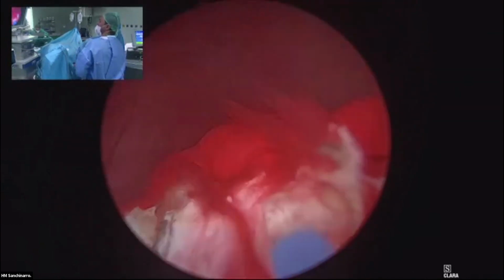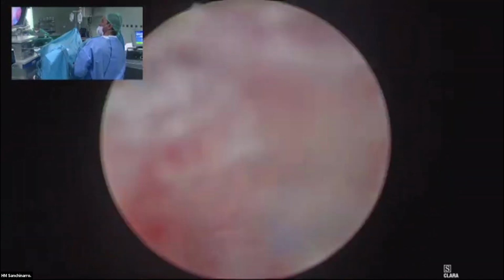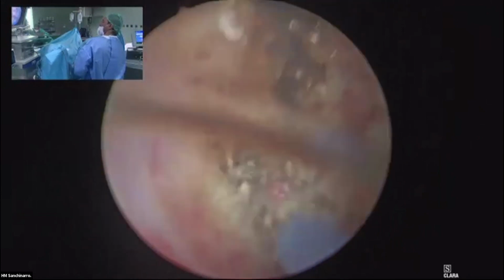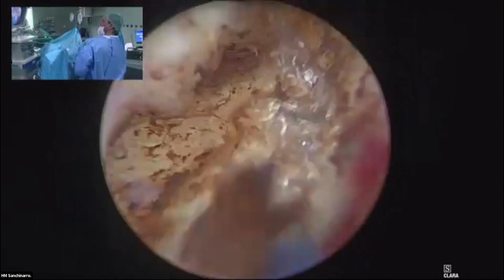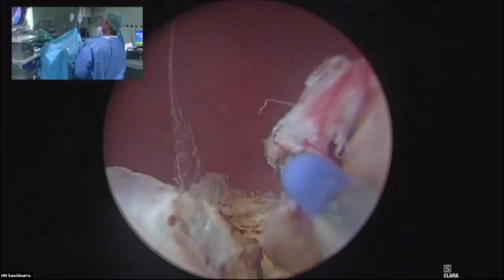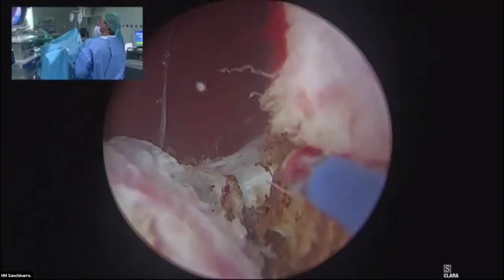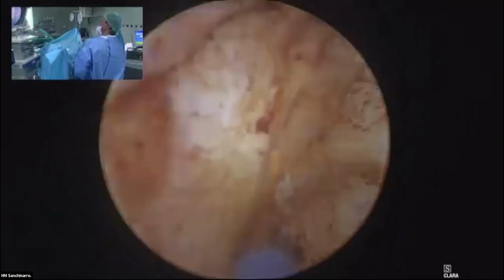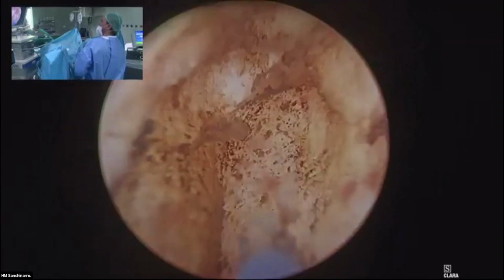And you see here at 5 o'clock, I have a not that big third lobe, but I'm doing it just to have a good situation at 6 o'clock, to detach on that part the two lateral lobes. You usually perform a ThuLEP technique like this? Yeah, usually yes. To get a good space. Yeah, this way I have space in between the lobes.